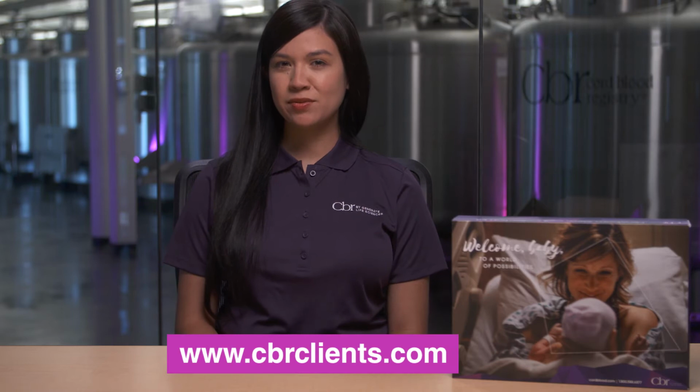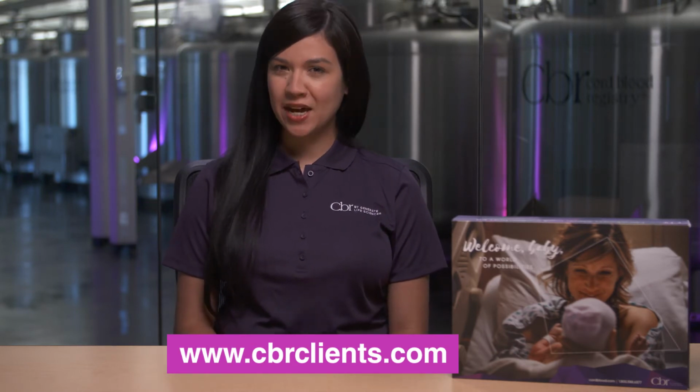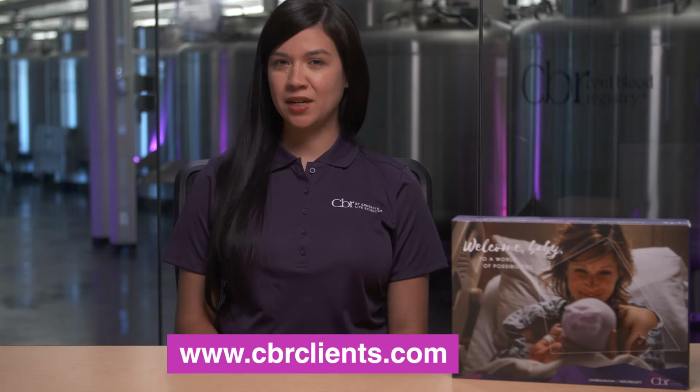Now that you've completed your enrollment with CBR to preserve your baby's newborn stem cells, there's only a few more steps to take. If you haven't already, please go online to www.cbrclients.com to create an account, register your kit, and complete your enrollment forms. You may have already received a kit from your doctor. If you haven't yet, we'll send one to your home. One thing to remember is to please keep the kit at room temperature.